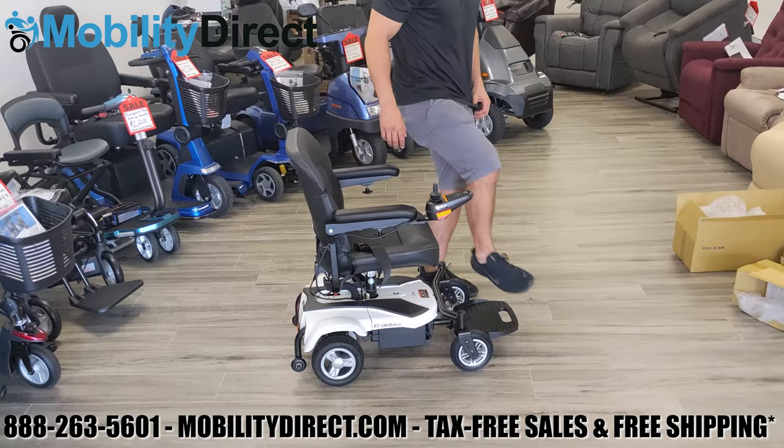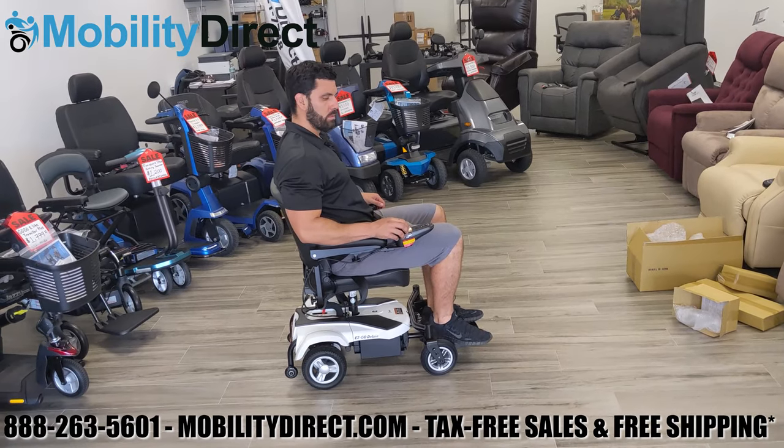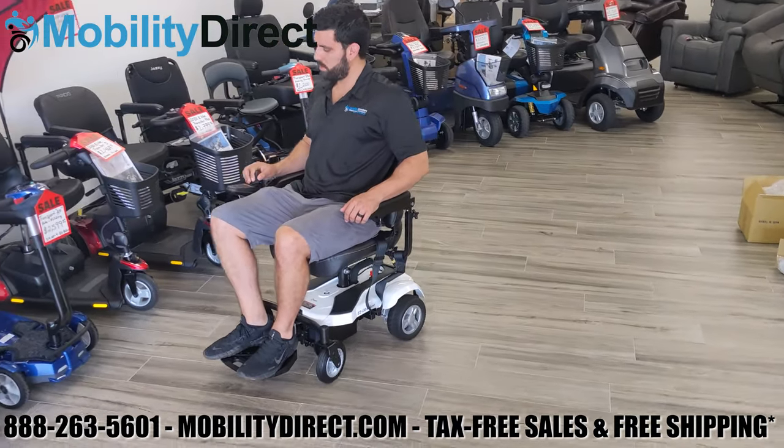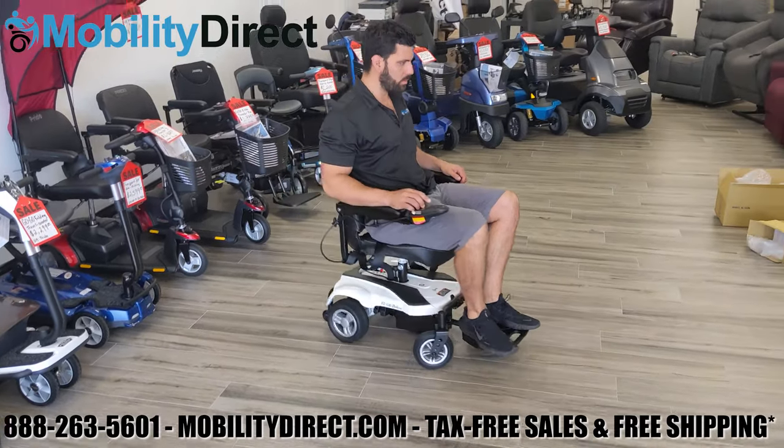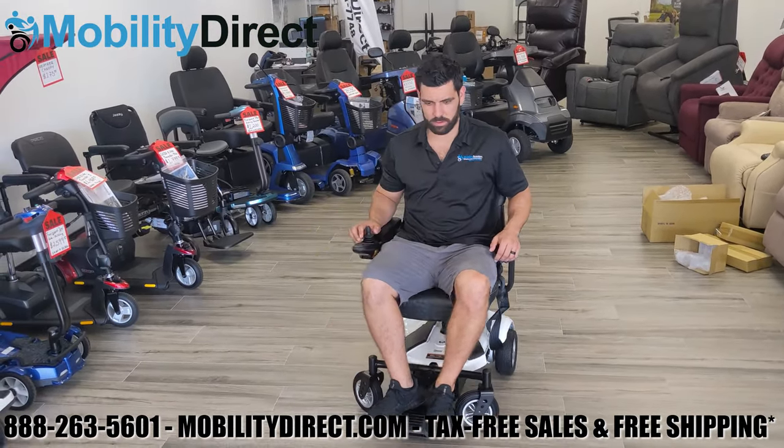Overall, this power wheelchair is very comfortable for someone like myself — about six feet tall and 210 pounds. It maneuvers very well, it's very quiet, and because it has automatic brakes, it's very safe.